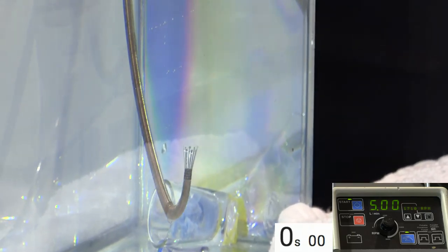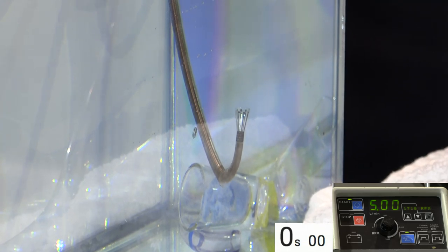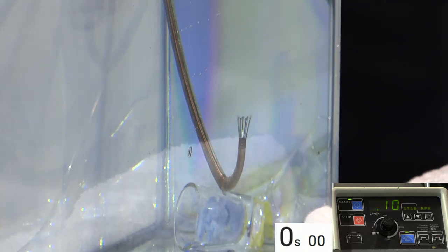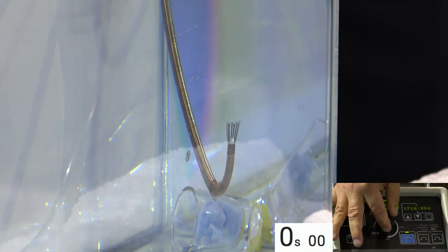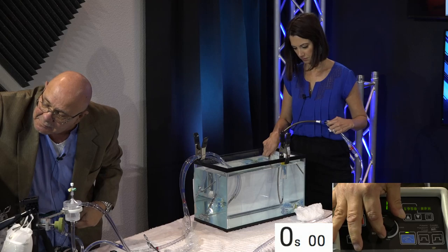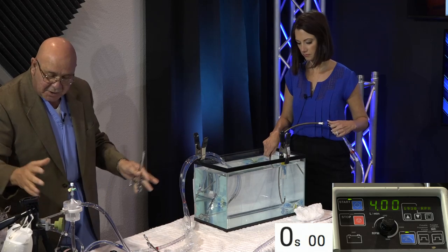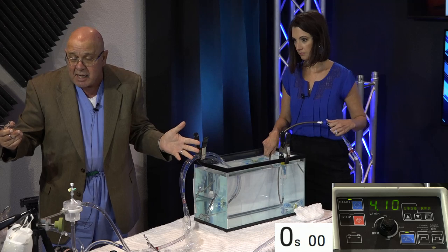So what we're going to do is we're going to switch our clamp. We're going to go from our current femoral cannula that we're on VA ECMO with, and I'm going to switch to the AngioVac catheter for ECMO. And you can see the flow dropped a little bit. I'll turn the RPMs up a little teeny bit. We'll get to 4 liters. And I think that's good. You can see the swirling right here. So we have a good situation where we're still on mechanical circulatory support. The patient's still being oxygenated.